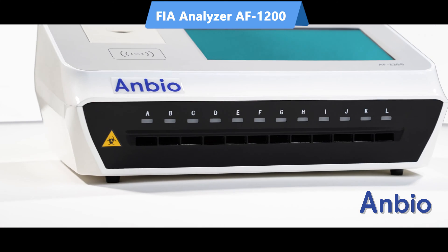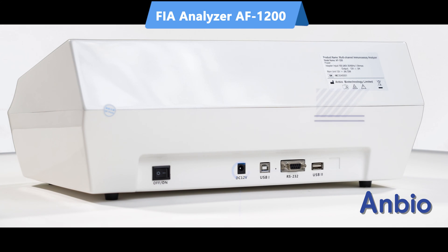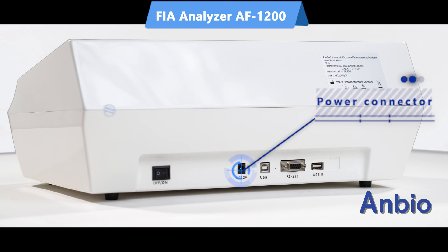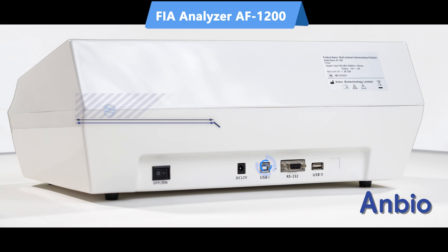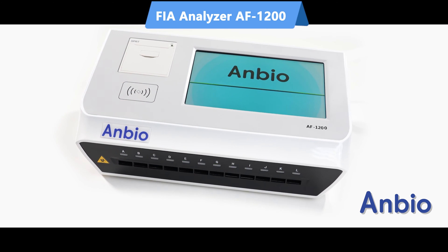The system offers precise incubation at 25 degrees centigrade, supports 8 languages for accessibility, features 12-channel simultaneous detection for efficiency, detects multiple specimen types, provides rapid results in 3 to 15 minutes, and is applicable across various settings.